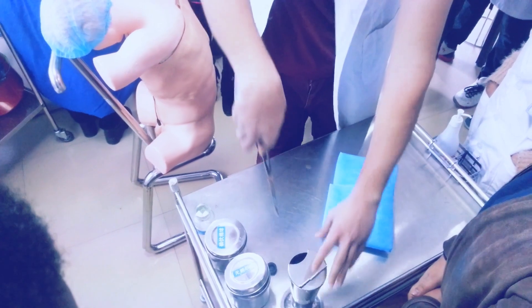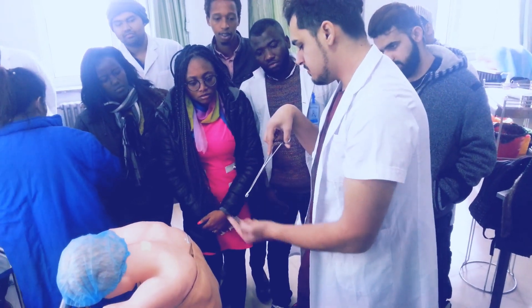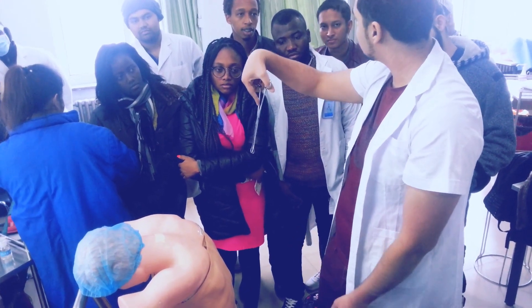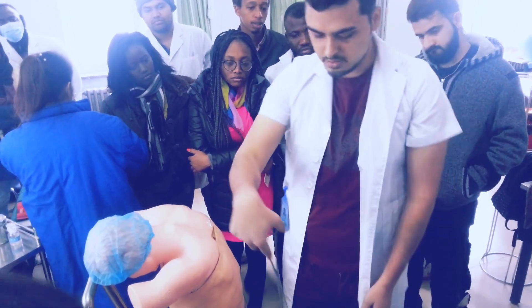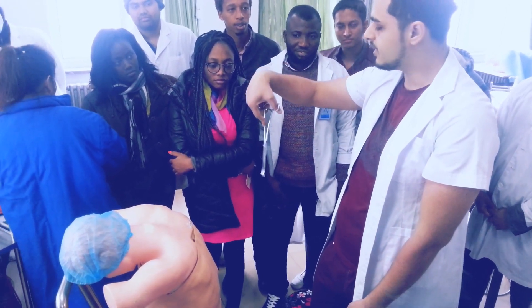You take it out like this. This is the clamp — and this clamp is not the right one; the other one is curved. Like you do it like this — this is a chicken paw. Like the feet of the chicken, it's always like this. So you do it like this, and then it always should be downwards. You cannot do it in any other direction, just like this. And then you open it.